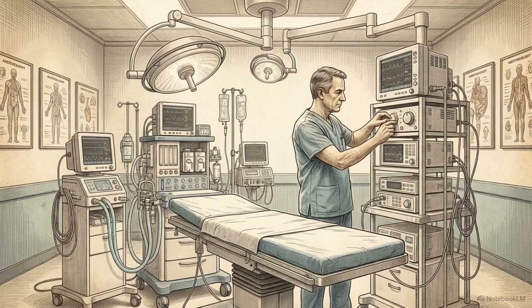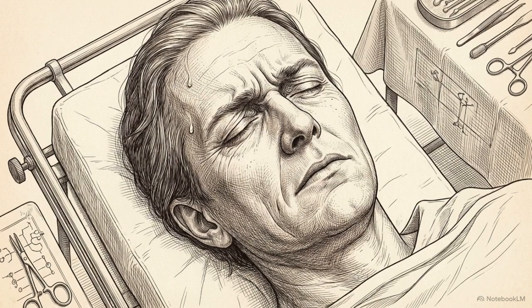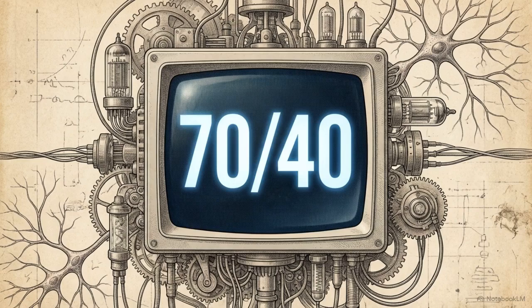In the operating room, the anesthesiologist walks a narrow physiological line. Deliver too little anesthetic, and the patient risks intraoperative awareness. Deliver too much, and the resulting hemodynamic instability can compromise perfusion to vital organs.